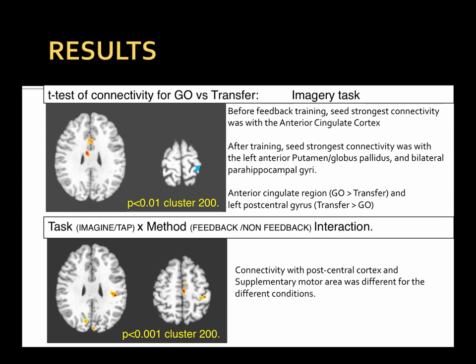And we see that the correlation increases during that. And we also see that the connectivity after training was higher with the basal ganglia areas that are part of the same network. So these could tell us somehow what things are involved in the process of the neurofeedback.